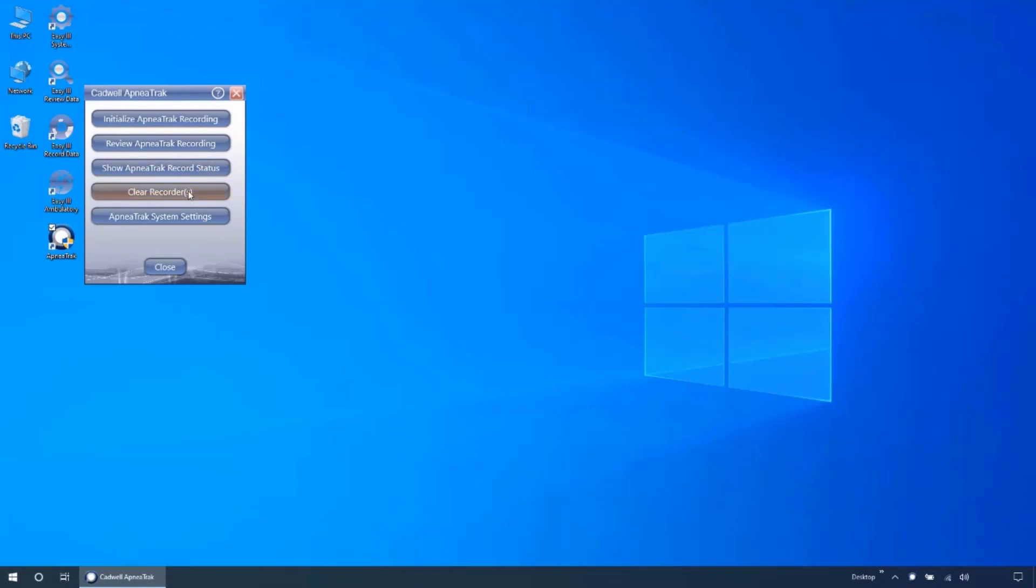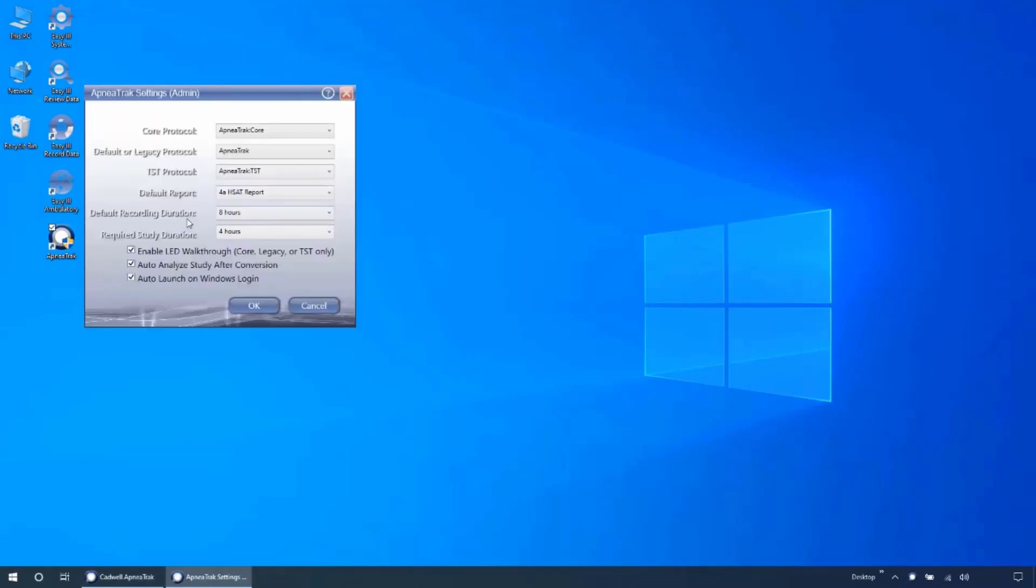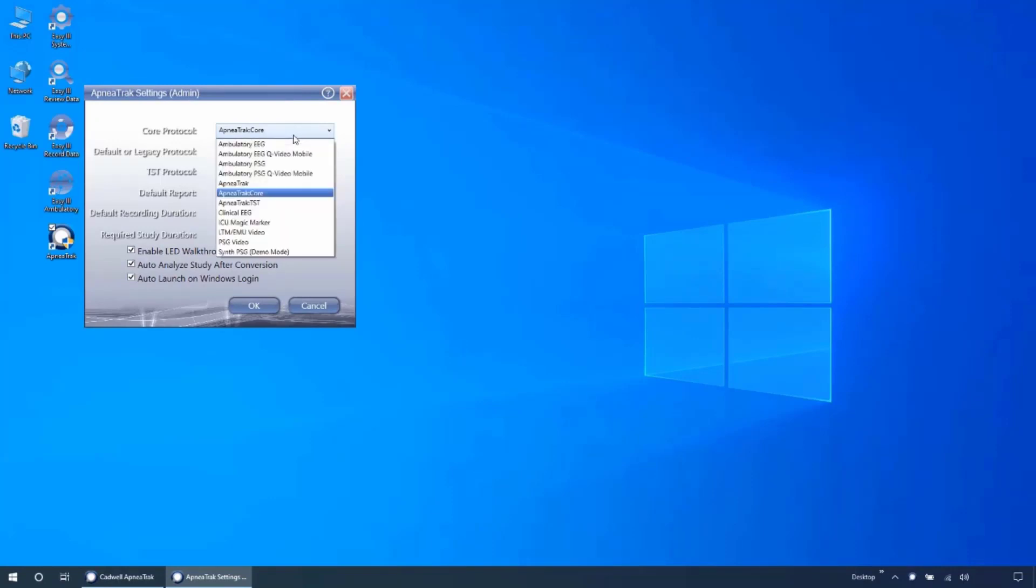Open the ApneaTrak settings menu. The first three fields are Protocol Selection. These configure how the studies appear when opened in EZ3.